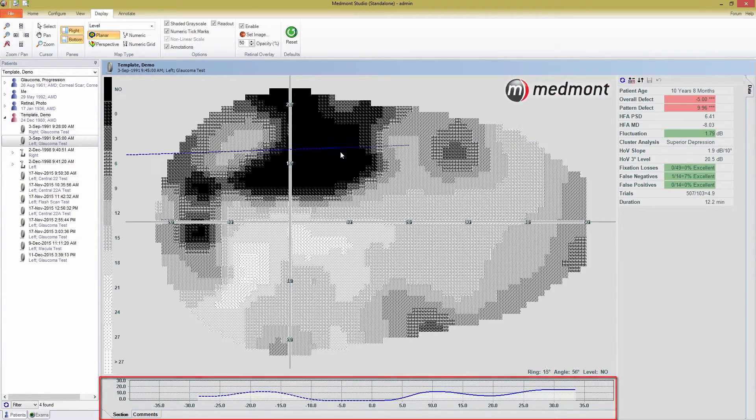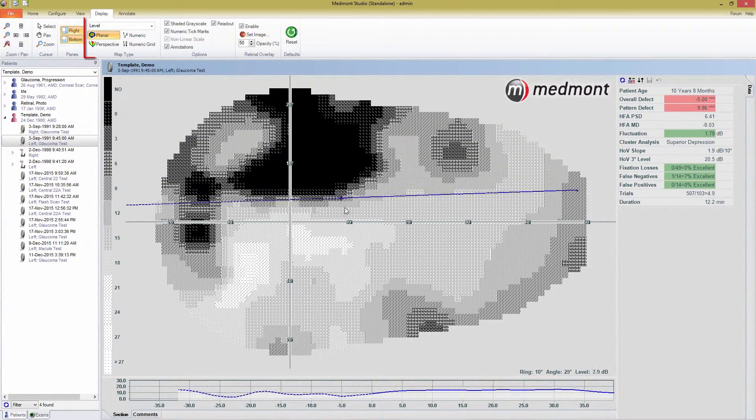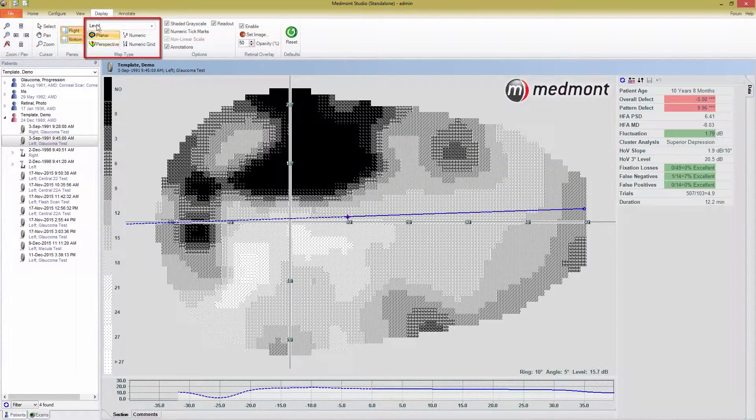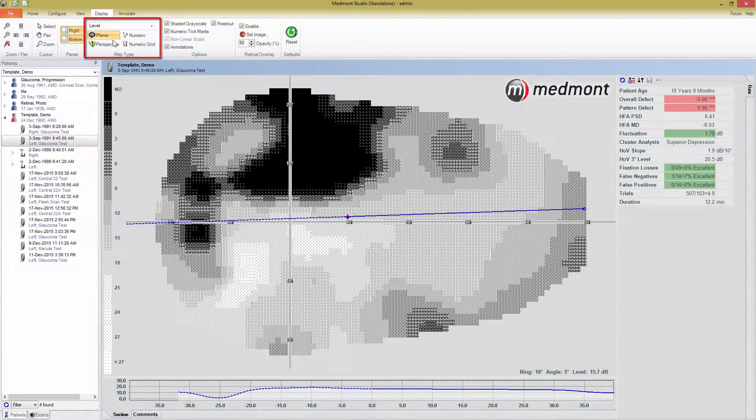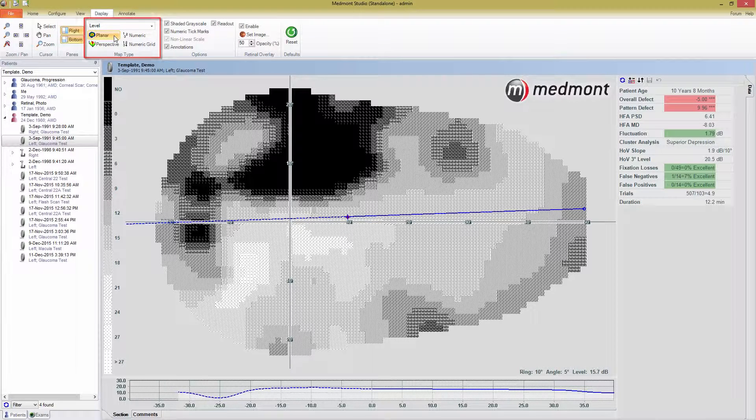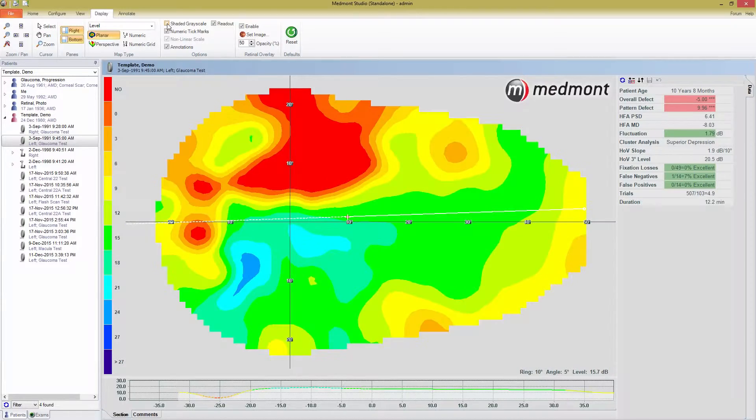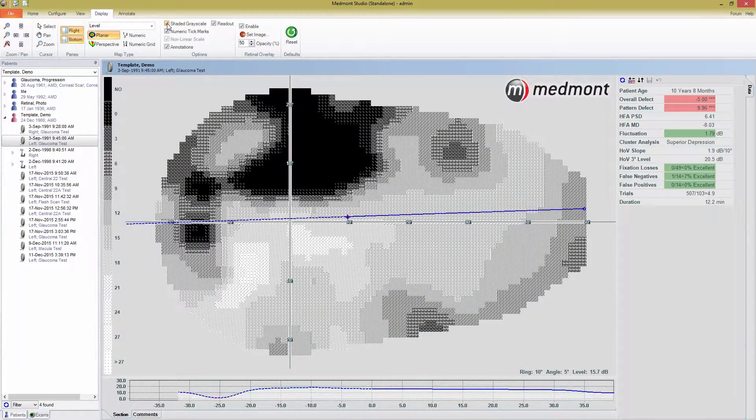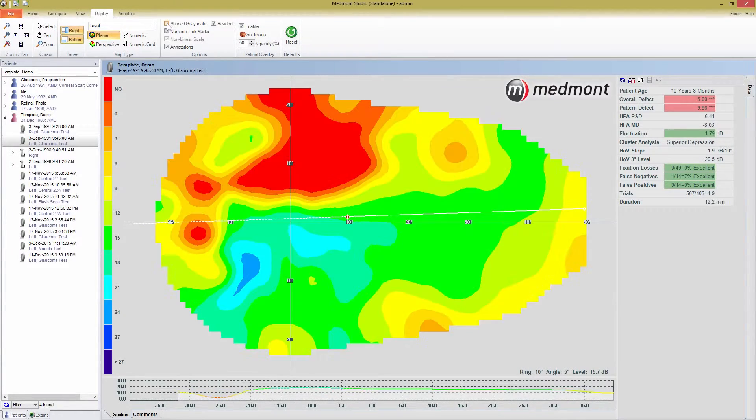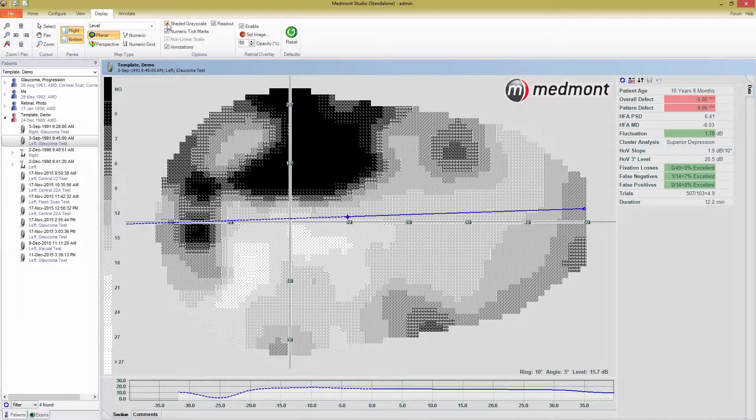In the map type section are your main options for changing the visual output of your data. The planar map is what we've been looking at up until this point. It can be displayed as a colored map or a shaded grayscale by clicking the shaded grayscale box in the options section. This map can also be viewed in a three-dimensional perspective map.